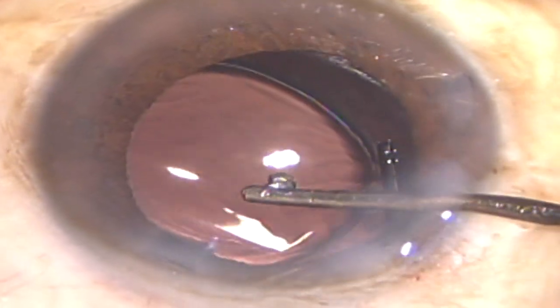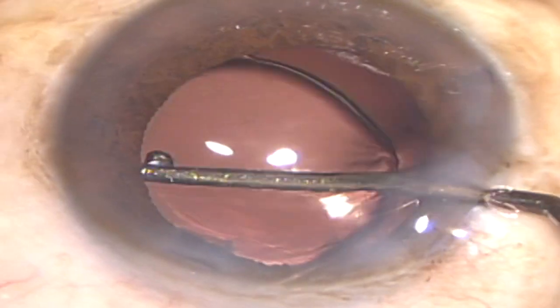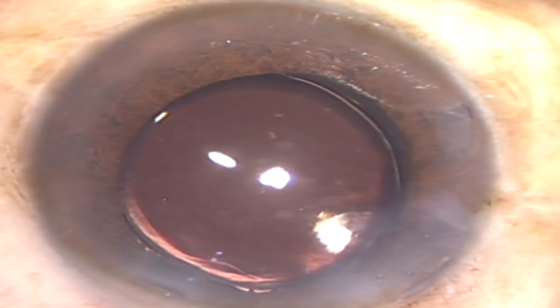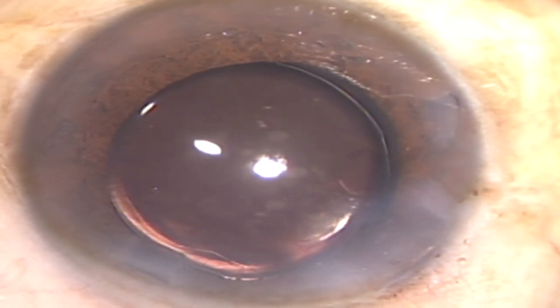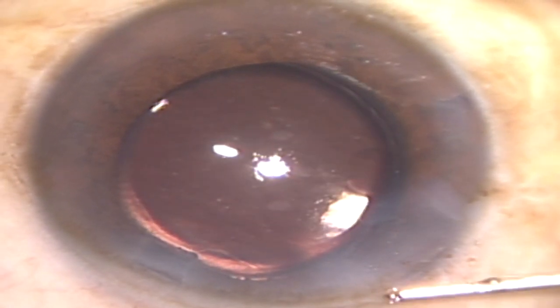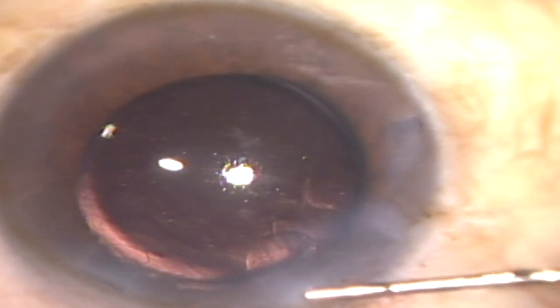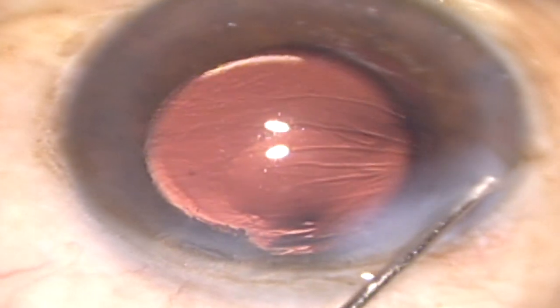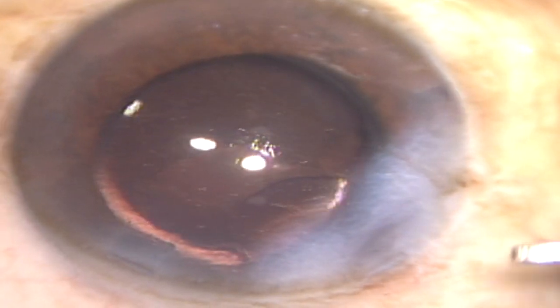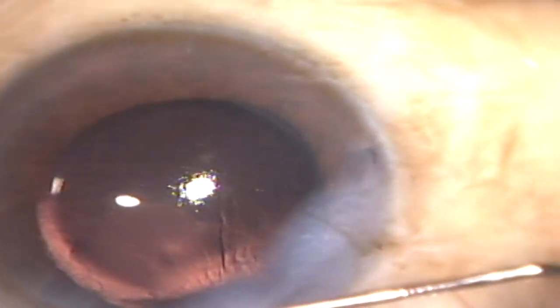The cornea is absolutely clear and there isn't much wound hydration needed. After the viscoelastic material is aspirated, I am hydrating the wound to seal the incisions — and this is how the surgery is successfully complete. Thank you very much for watching this video.